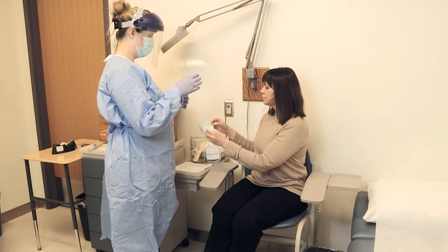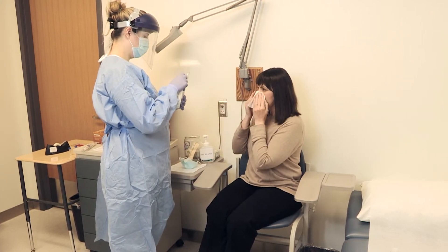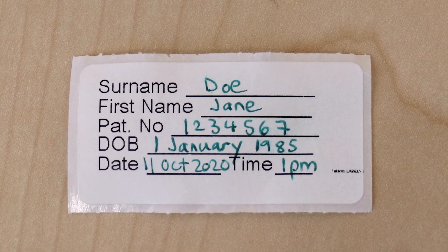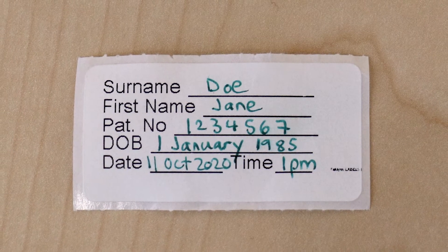Ask the patient to remove their mask and wipe their nose with a clean tissue. Make sure the collection tube has the patient's name, date of birth, and collection date.